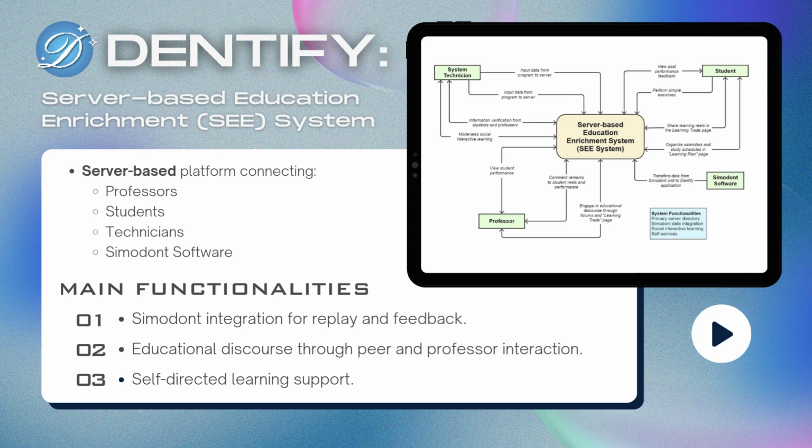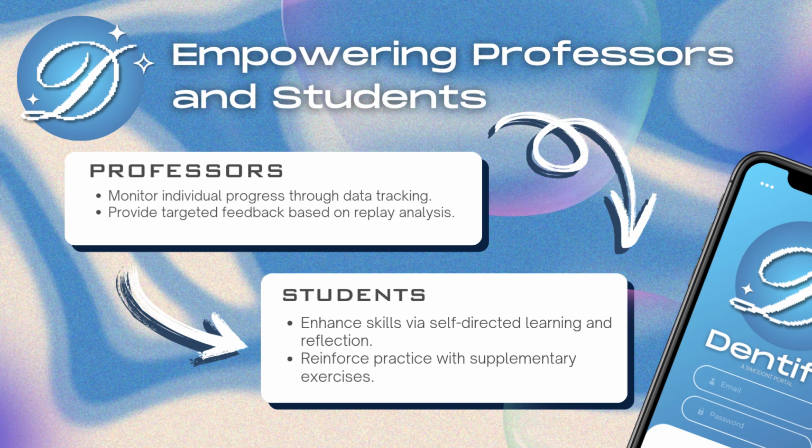Dentify is a server-based educational enrichment platform designed to enhance dental training at UPCD. This conceptual model outlines the interaction between key stakeholders: students, professors, technicians, and the Simodont software. At its core, Dentify integrates Simodont data with server-based functionalities, enabling features like replay sessions, feedback, and collaborative learning. These components aim to address the challenges of limited machine access and create a more interactive and accessible learning experience.